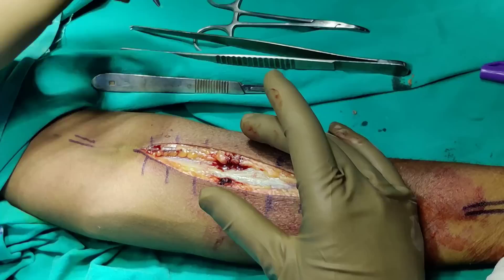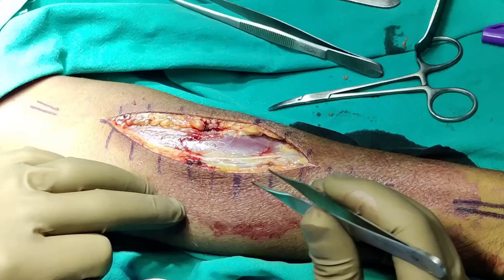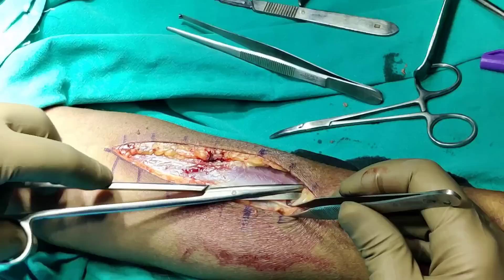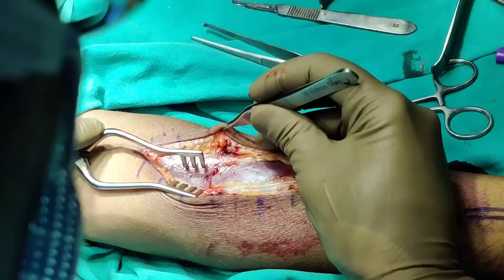Stay in the same line. The first thing you will see is the cutaneous nerve — you can start seeing it here. Try to protect and respect every single cutaneous nerve that you see. There is no point cutting it because you gain nothing, and if you cut it, they can form a painful neuroma. So far we have taken the skin down, subcutaneous tissue, and fat layer. I have tried to protect the cutaneous nerve and mobilized some superficial veins out of the surgical field. I am now going to reposition my subcutaneous retractor and carry on dissection in the same line.